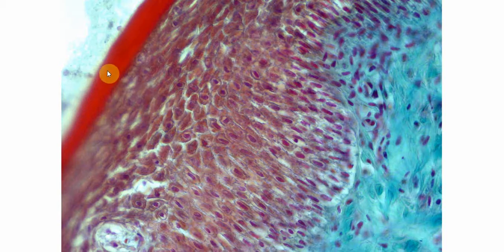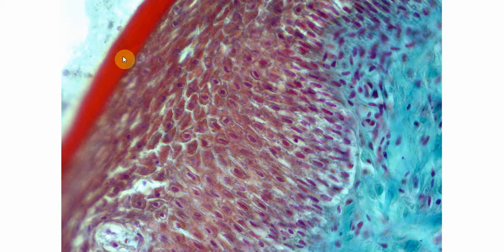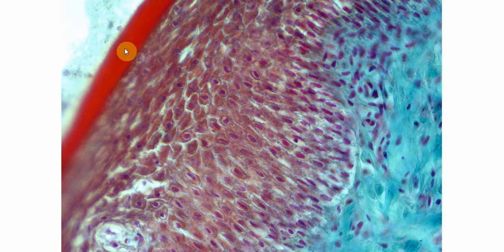The topmost and the last layer is the cornified layer, in which the cells are extremely flattened and all the organelles are lost, including the nucleus. No nucleus is visible here. The cells are filled with a material known as keratin. Because no nucleus is visible, this pattern is referred to as orthokeratinization.